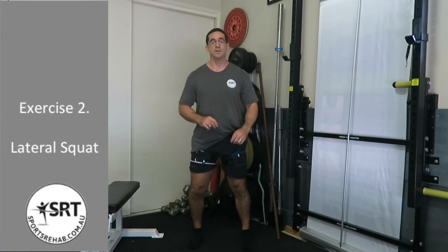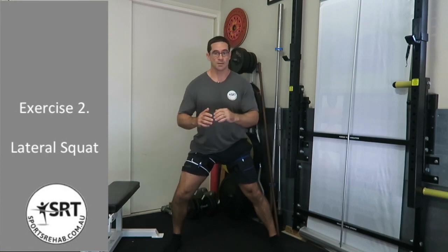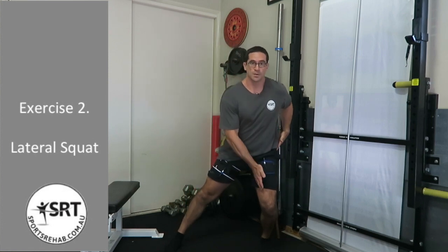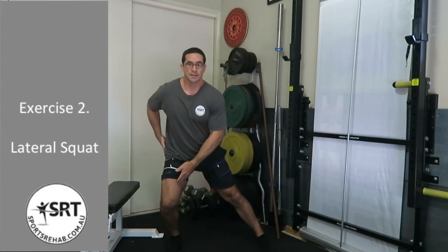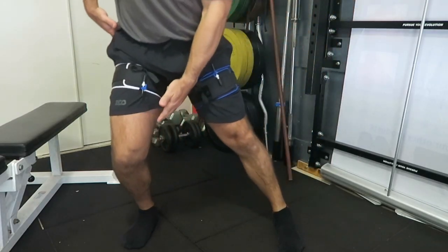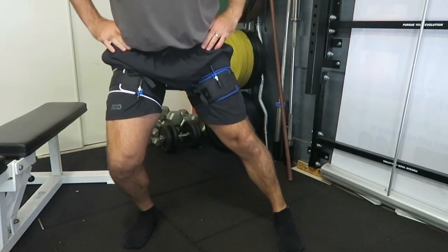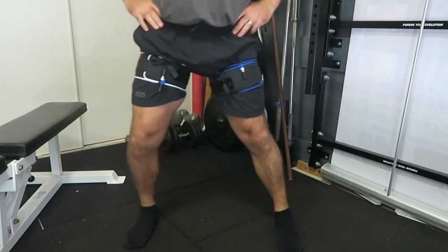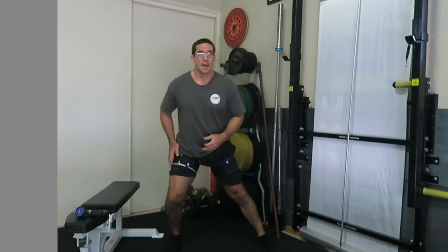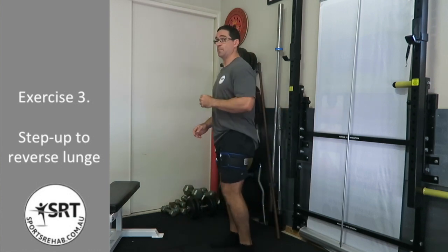My second movement is a lateral lunge or lateral lunge squat. I'm just going to move gently to one side, trying to get alignment of hip, knee, toe, so adding a straight movement into now a lateral movement. Once again, similar to the squats, as each rep continues, I'm able to work on more range of movement according to how I feel, because I know in my second set I'm going to be able to achieve more range and I'll have more muscle activation.